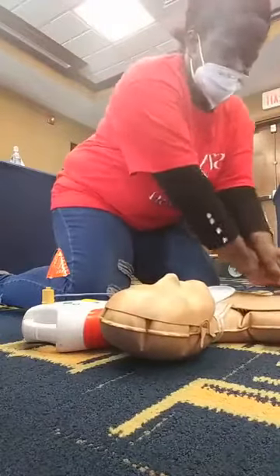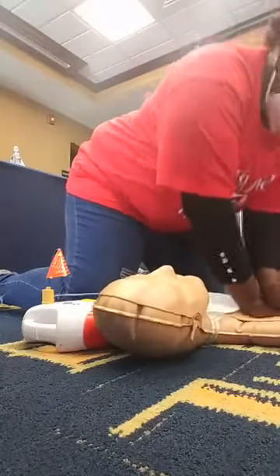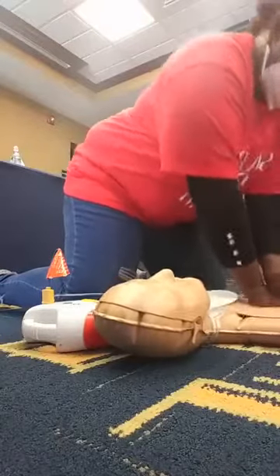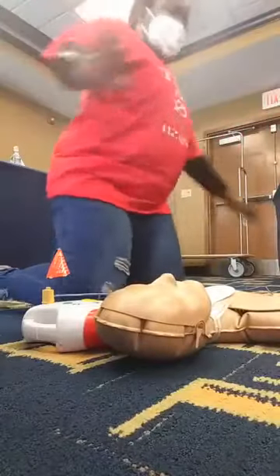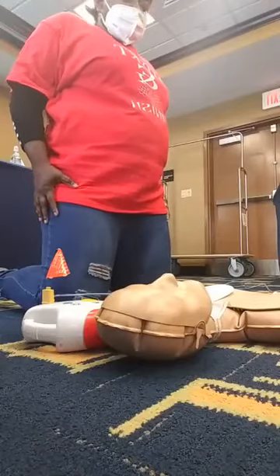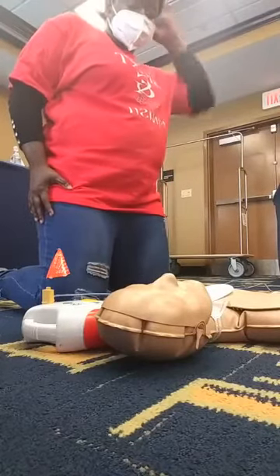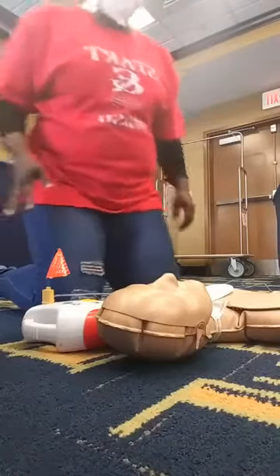Two breaths. Stop compression. Everyone clear. No shock advised. Okay. Begin 5 cycles of CPR. And then you'll resume doing the compressions.